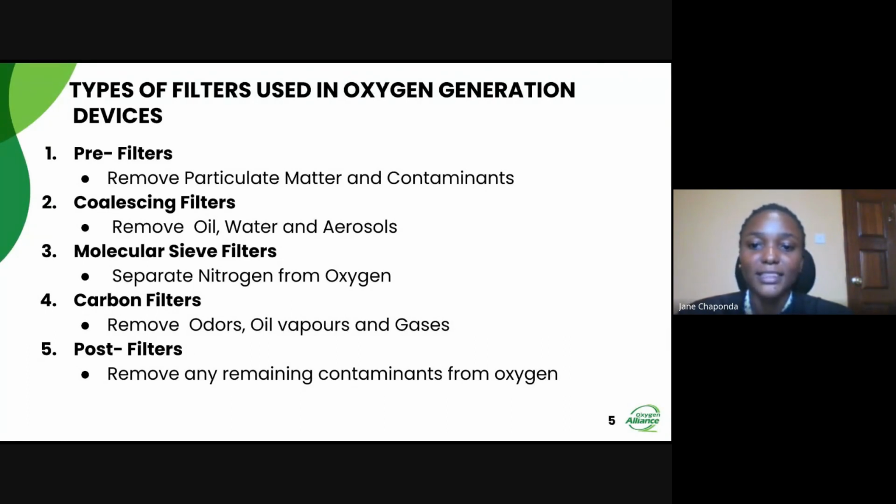And the other type is the carbon filters. And these ones, they are equipped with activated carbon. And these filters, they absorb odors, oil vapors, as well as gases. And the final type is the post filters. So these ones, they serve as the final stage of filtration, they capture any remaining impurities or contaminants from the produced oxygen.